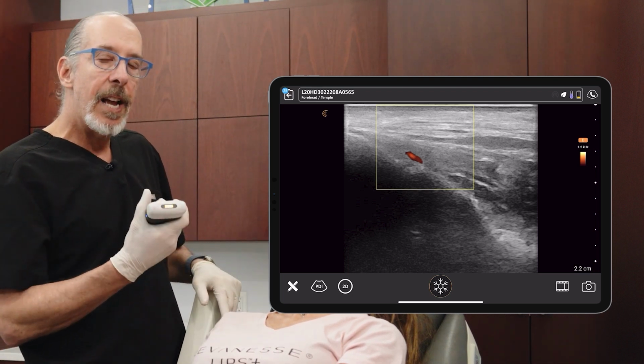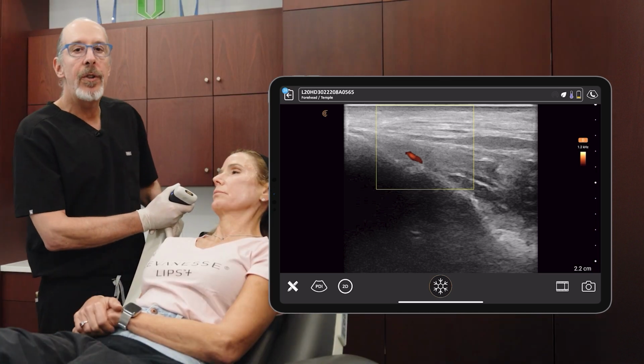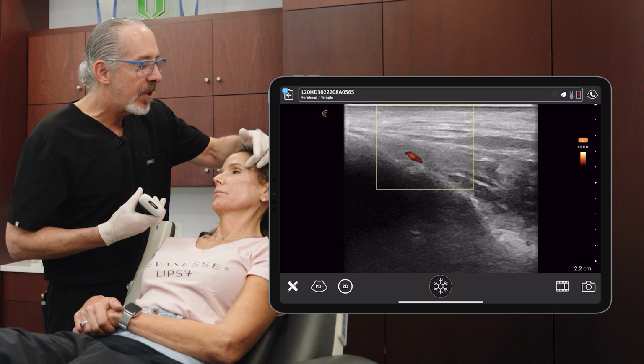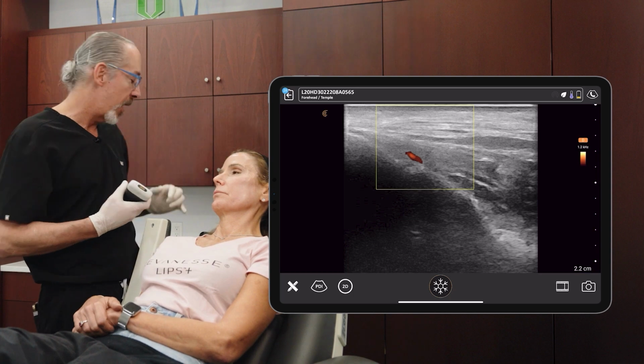And that's actually at risk when you're doing those deep injections. So I highly recommend doing vascular mapping before you do the deep injections in the temple to look for this deep temporal artery. And in this patient, it was very close to the injection point that you like to use for this one up, one over technique in that deep area.